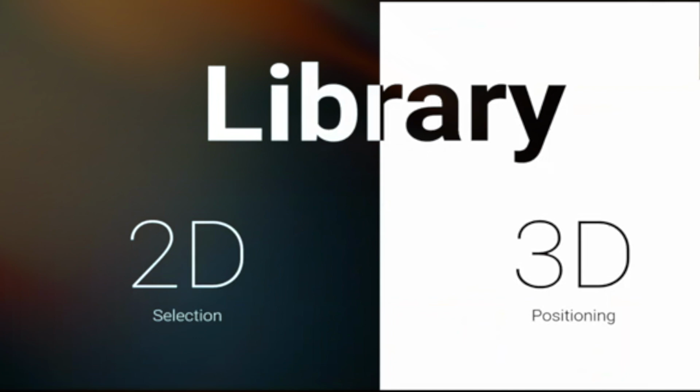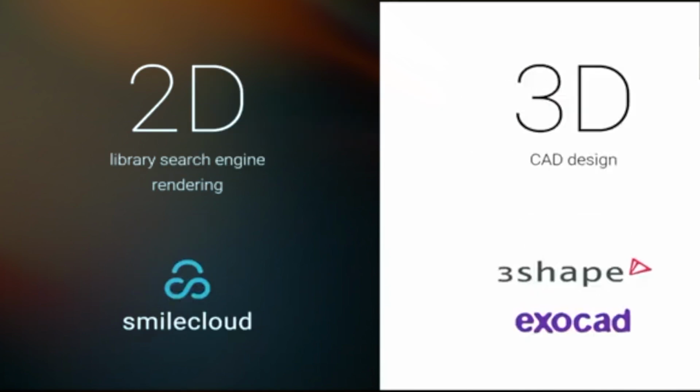Now, in prosthetics, design is these two things. You need to select the library and you need to position the library. Now, the selection is generally done in 2D and the positioning is done in 3D in a CAD software. This is how we do it today. So in 2D, we use SmileCloud, the technology which we were involved in developing, where this works as a library search engine, where you can search in real time for certain parameters specific to the case of a library you're going to use. You can also render it in real time.